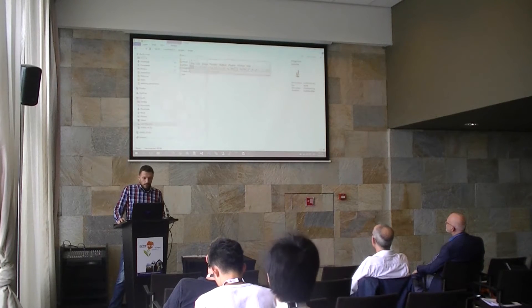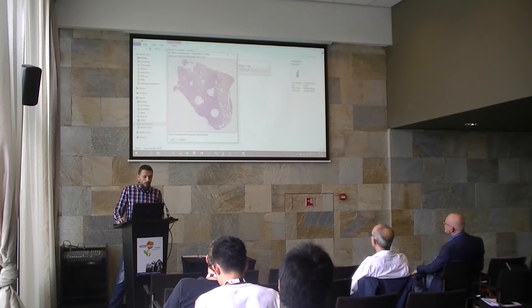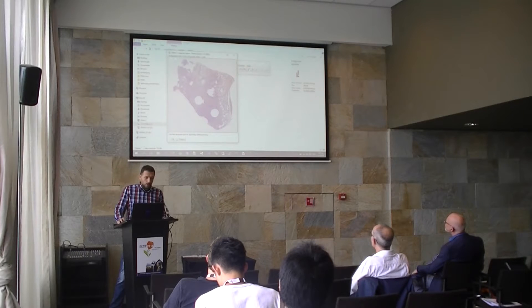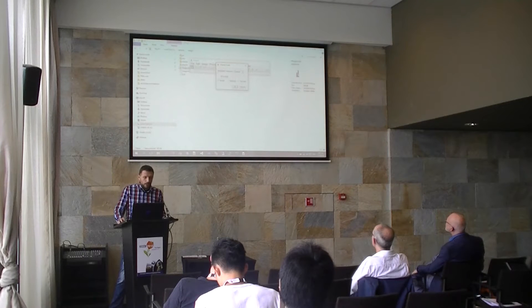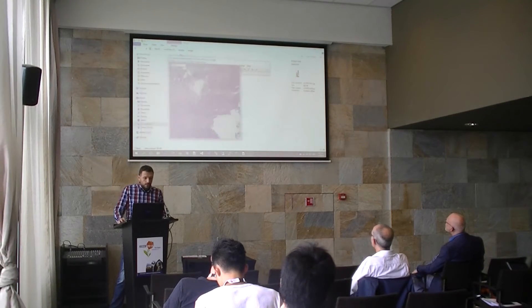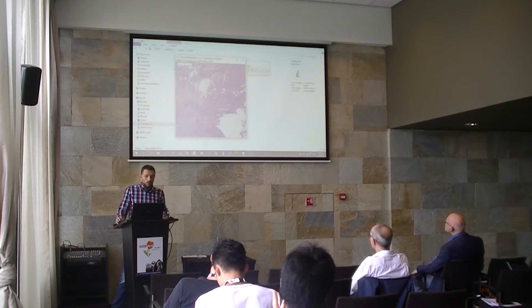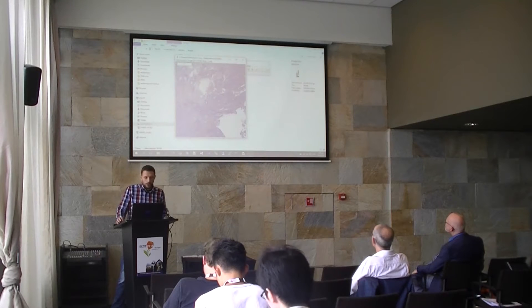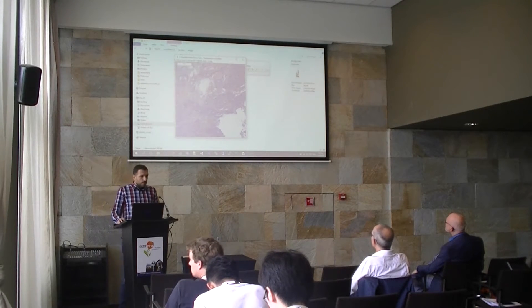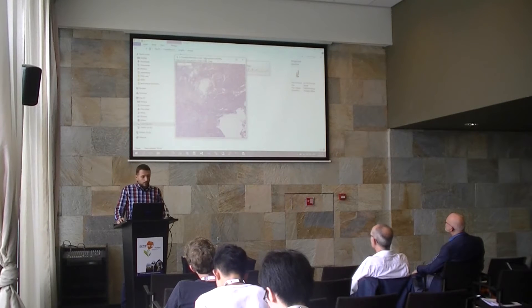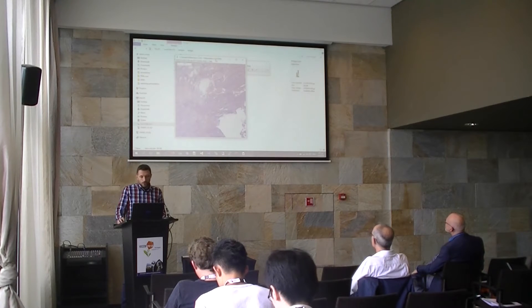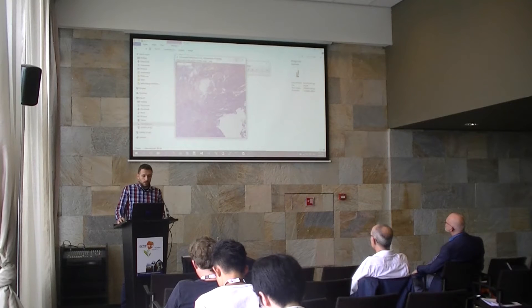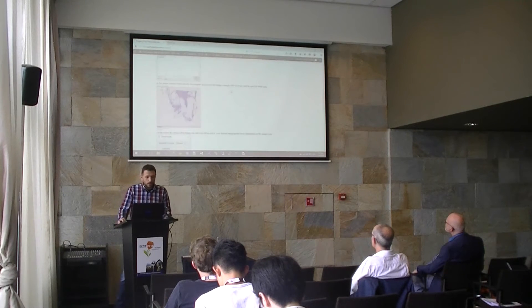Here's how it's done. We have the plugin — you open it, select the image you want to open, and you can also crop the region that you want to see. Then you select how big you want the image to be, and there you have it. From now on you can continue doing image analysis as you regularly do within ImageJ. Furthermore, this plugin can also be used from the command line and can be automated, so you don't have to use the mouse to decide which images to load and what tasks to run on them.